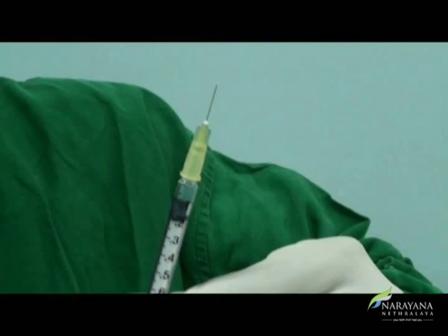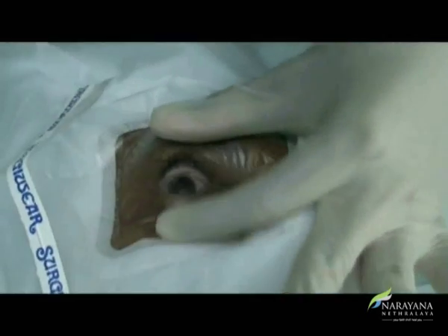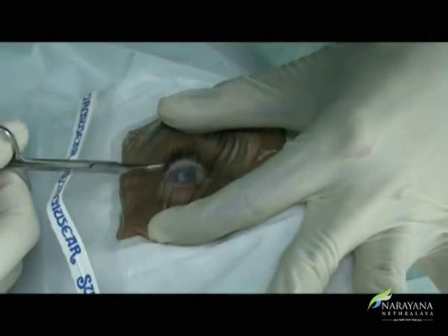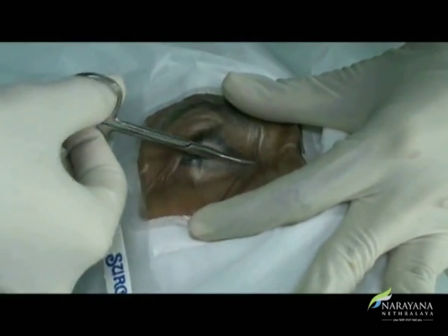Discard extra drug to make the volume 0.05 ml after placing the 30-gauge needle over the syringe, and ensure no air is present in the hub. The eye is draped with a sterile, preferably disposable, drape. A good drape keeps away the patient's oral and nasopharyngeal flora from the surgical field, and the surgeon prevents their own by wearing a mask. Lashes are draped properly while putting in the speculum to keep them away from the surgical field.